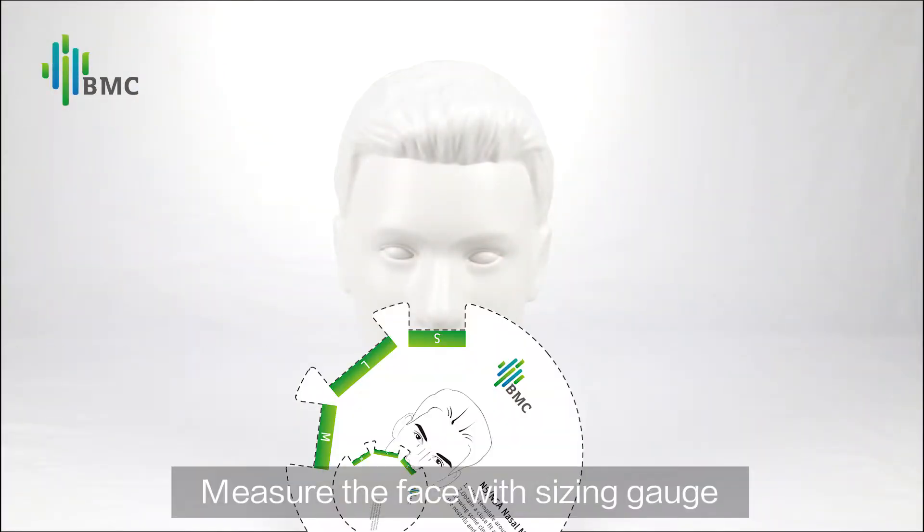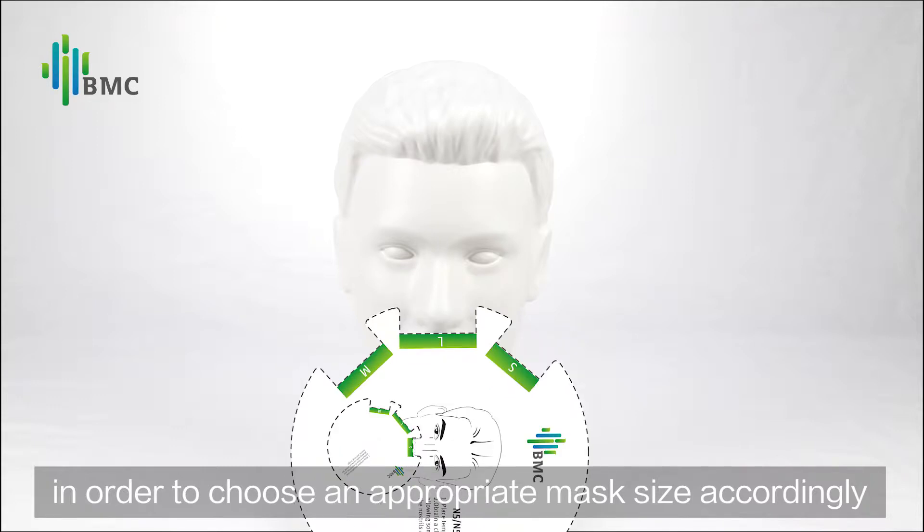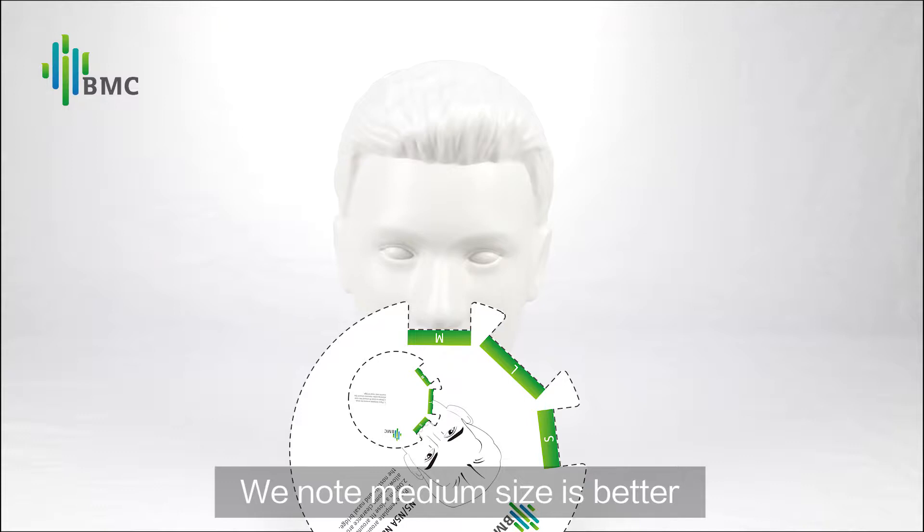Choosing the mask: Measure the face with the sizing gauge in order to choose an appropriate mask size accordingly. Note that medium size is better.